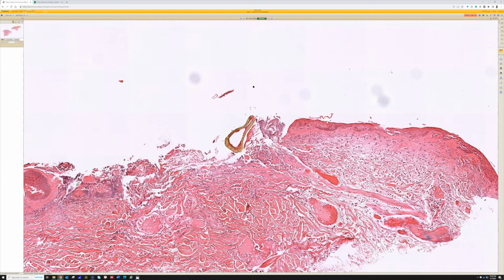So you have to look at where the arthropod part is located, how big it is, what the clinical scenario is, and sometimes also take the travel history into account. And then you can figure out what type of arthropod you're dealing with. And the other thing is, occasionally I've found arthropod parts that have been contaminants, especially on a large chronic ulcer. Or on top of an ulcerated skin tumor, I've sometimes seen little bits of arthropod that got stuck in the crust.